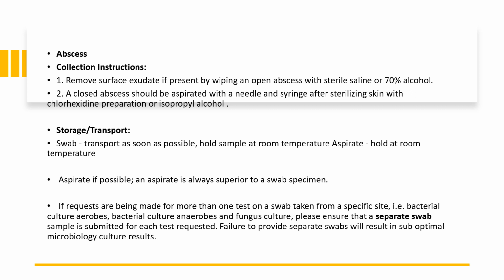If a request is made for more than one test on a swab, such as bacterial culture for aerobes, bacterial culture for anaerobes, and fungal culture, please ensure that a separate swab is collected for each test. Failure to provide a separate swab for each test will result in suboptimal results.